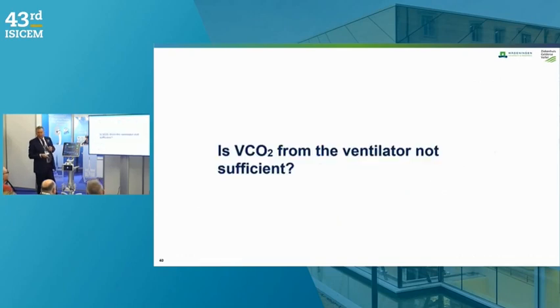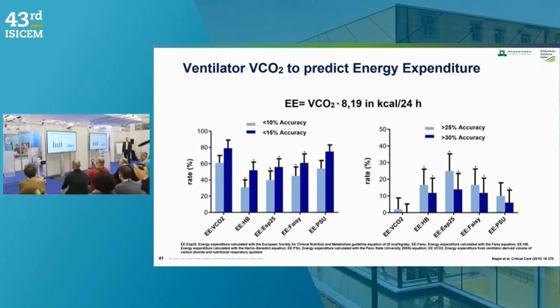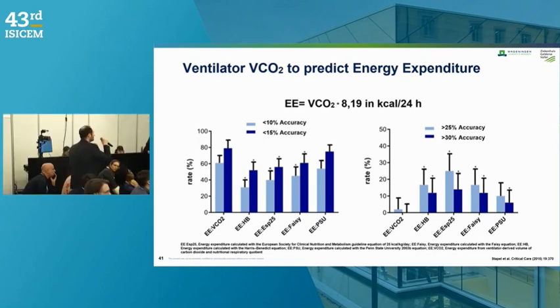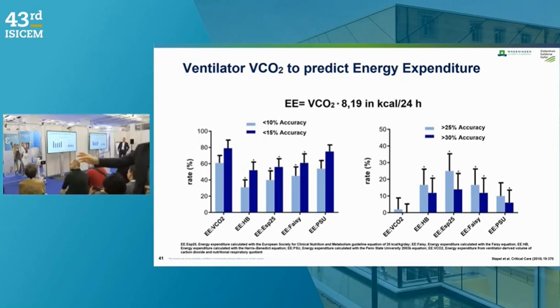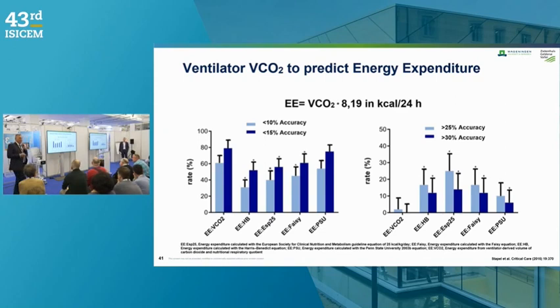So we discussed this before. Yes, please. Do you have any data on patients under inhaled sedation like sevoflurane? I don't know if you use it, but can you use indirect calorimetry for these patients? Do you know that? Yes, we use it with isoflurane, with this module, and it works very good. Okay. Can be done. Also no contraindication then.